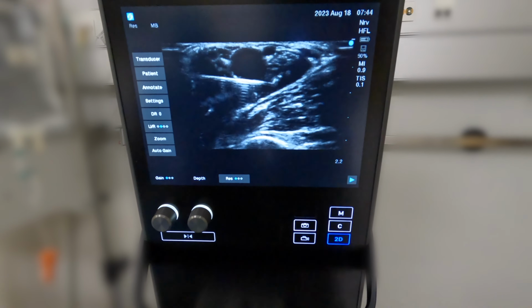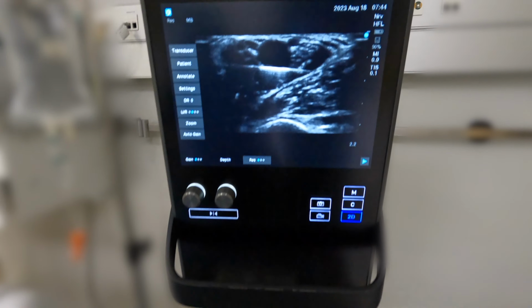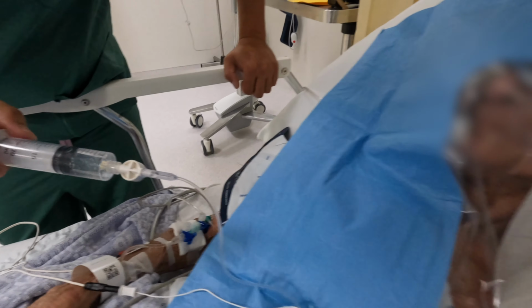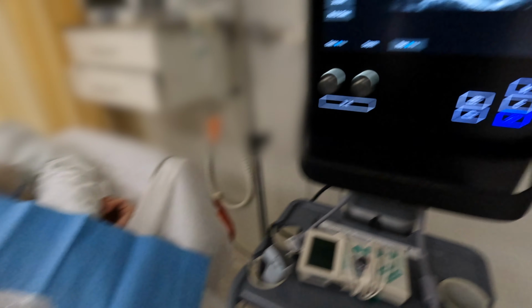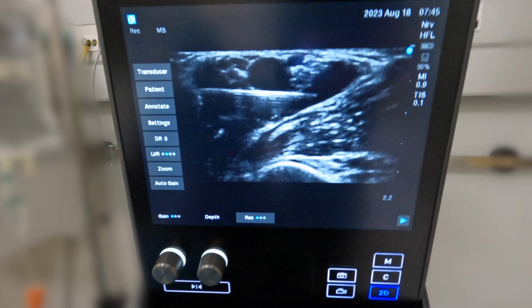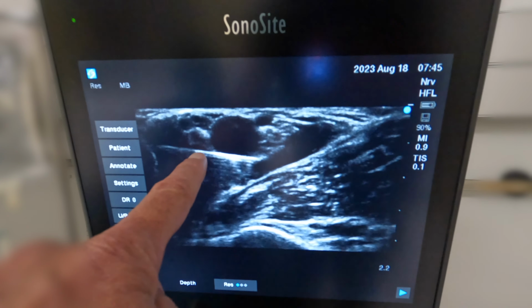Okay. Advance a tiny bit more, just a tiny bit more. That's good. Into that pool of local anesthetic. Stop. Good. Aspirate. Aspiration is negative again. And inject 1 cc. There you go. So that's filling up the space pretty nicely. We're done there. Okay, let's go back with your needle to the median nerve.